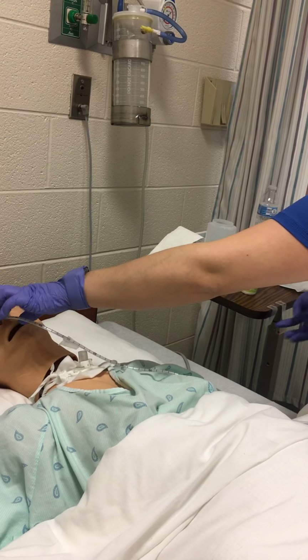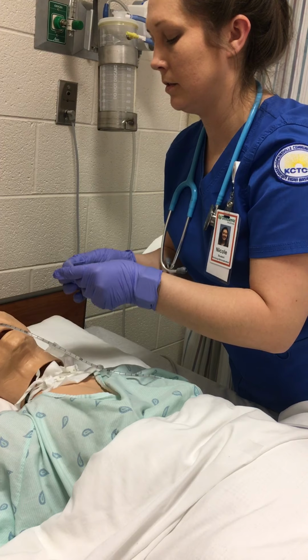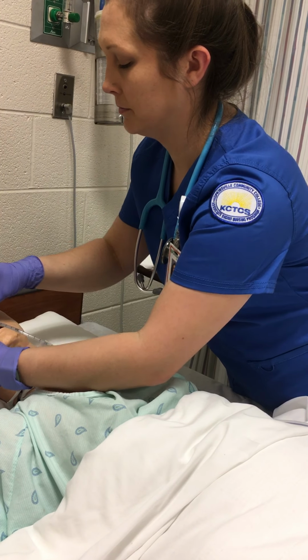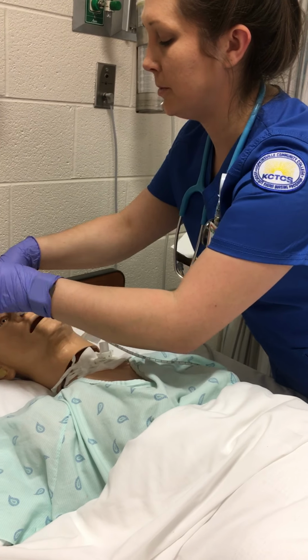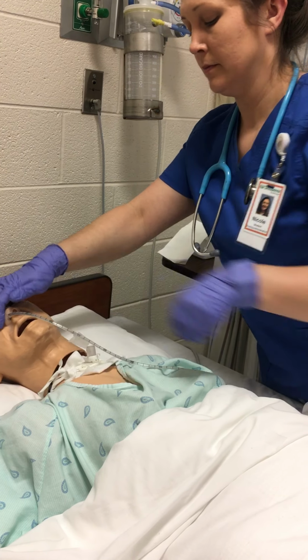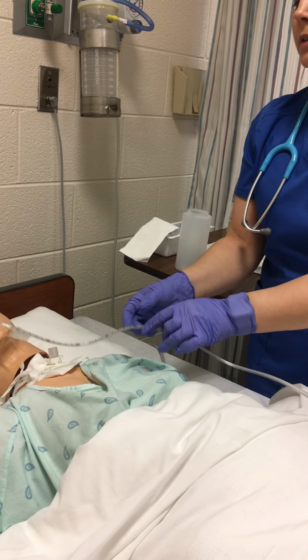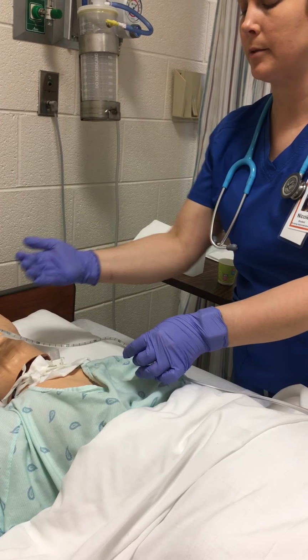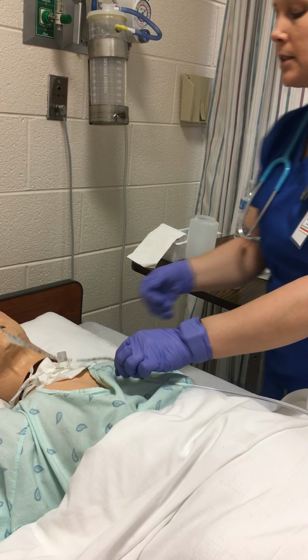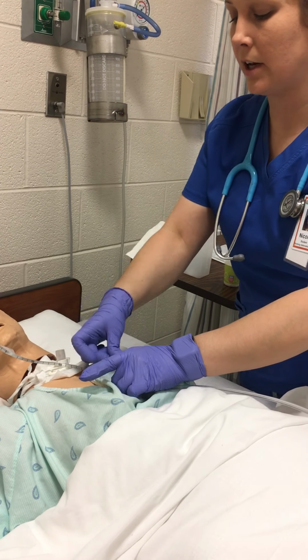Then I'm going to tape the tubing to his nose. And then I'm going to tape the tubing to his gown as well. So I'm going to ask the patient to move their head from left to right to make sure that there's some leeway for him to move his head around. And then I'm going to tape it to his gown.